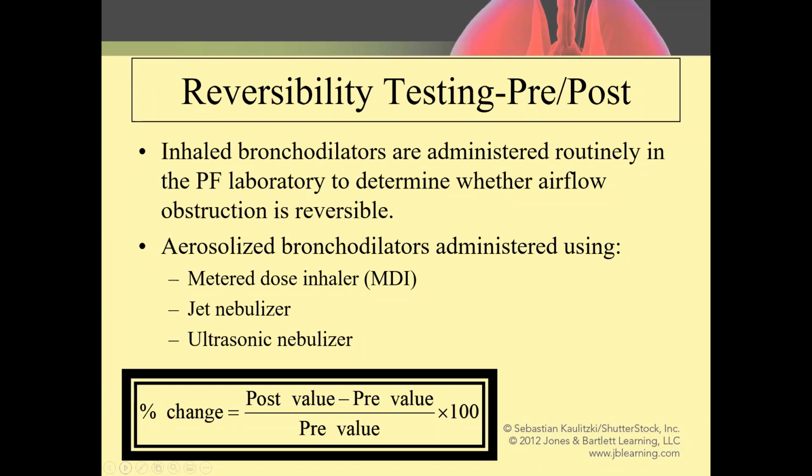In some patients who are very debilitated, understand that even if the change is 5, 6, 7%, the idea is they're so debilitated, their asthma, their COPD is so bad, that any improvement is deemed worthwhile in getting them on the regimen.